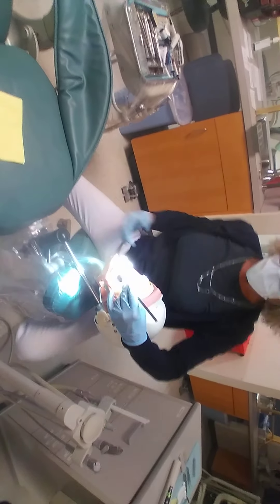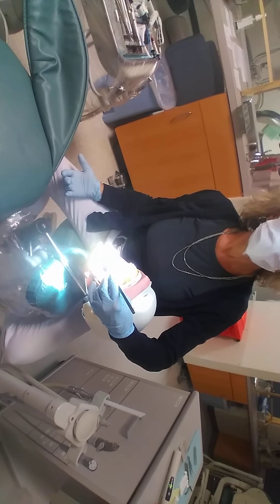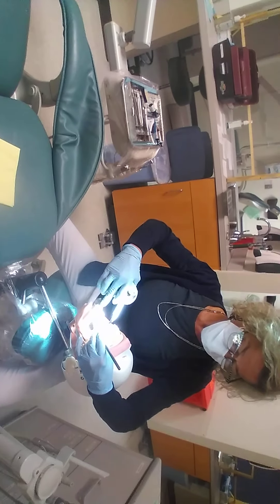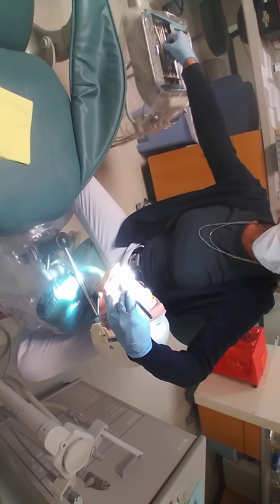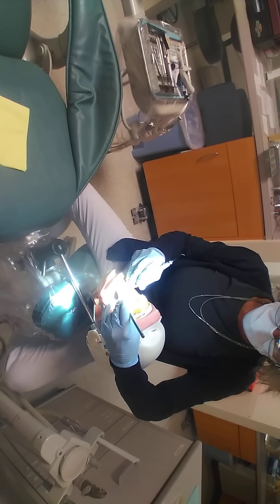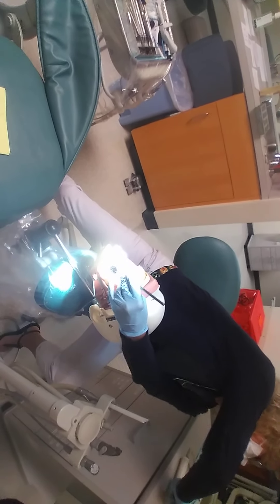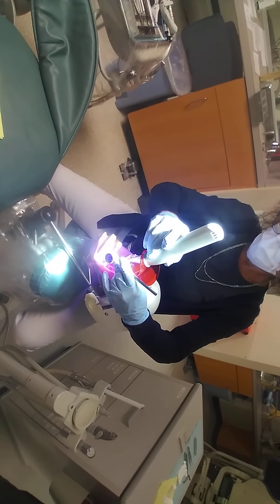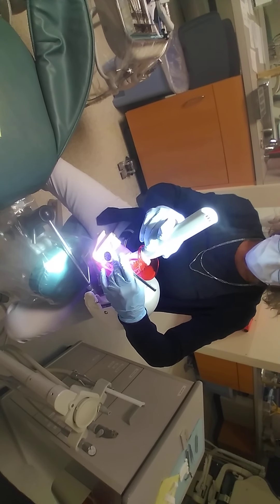After 20 seconds of curing, I have my oxygen-inhibited layer again — that uncured resin which is my bonding agent. Now I'm going to take my universal composite, which has more fillers in it, and extrude it into the cavity preparation. I'd use some type of plugger or composite instrument to place it down, building it up 2 millimeters in thickness. I would cure it making sure it's 90 degrees perpendicular to the long axis of that surface — and because it has fillers, we're curing for 20 seconds.